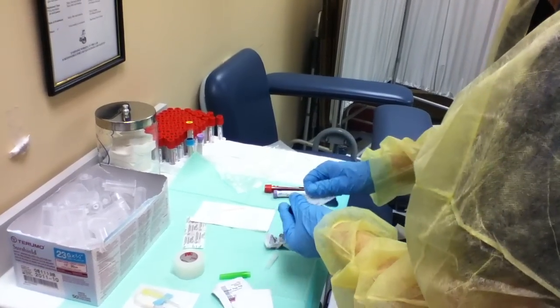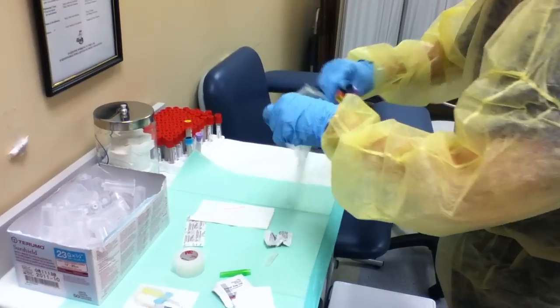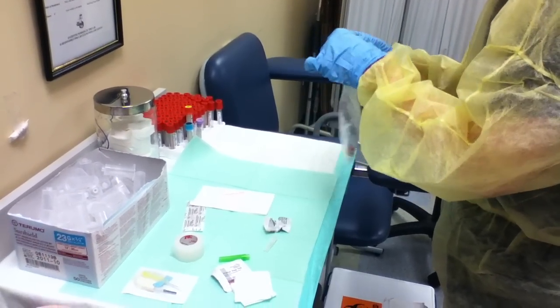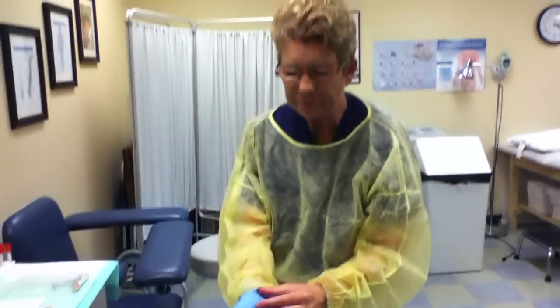When you're all done, you're going to put all your tubes in a lab bag, seal that up, and transport it to the lab. You're going to take your gloves off, walk back over to the sink, wash your hands, and go out and document the procedure in the chart. Thank you very much — that's a quick venipuncture for you.